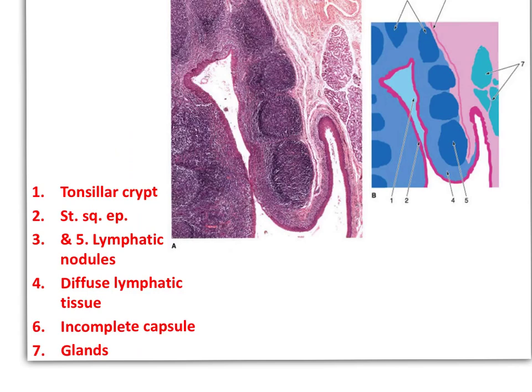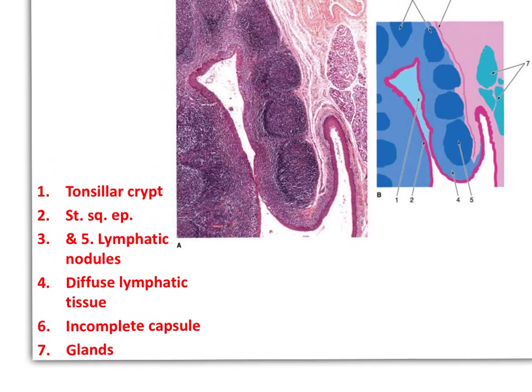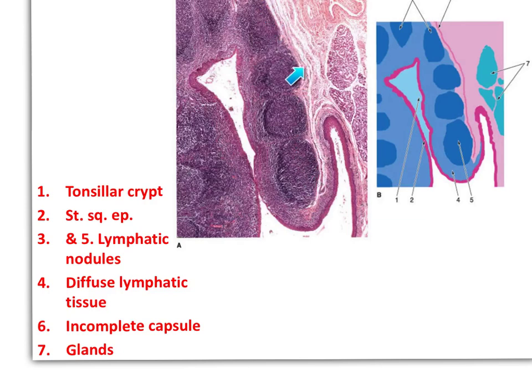You can see here the non-keratinized stratified squamous epithelium passing through the crypt and lining it. We have the lymphatic nodules with germinal centers, and in between we have diffuse lymphatic tissue. Here on the other side of the tonsil facing the epithelium, you have the capsule. It is not complete — it is present only at one part of the tonsil.